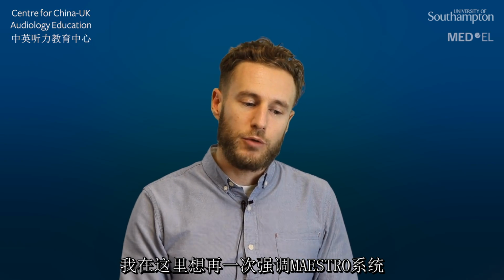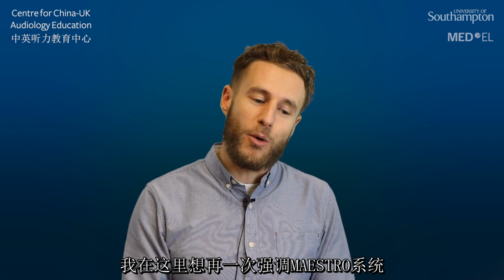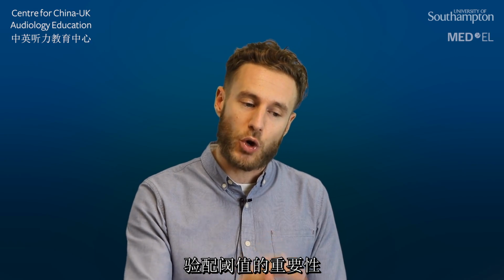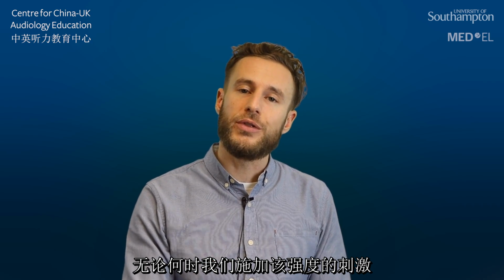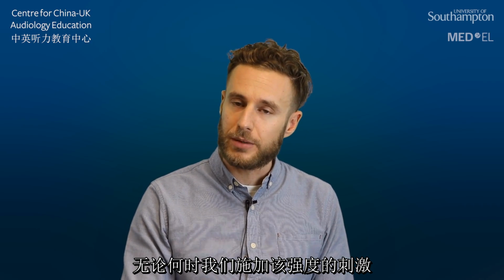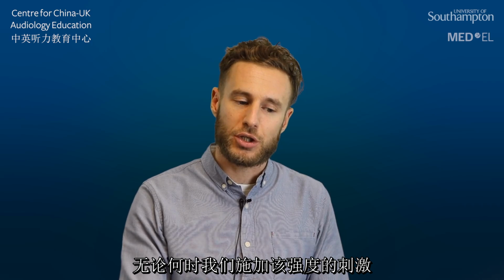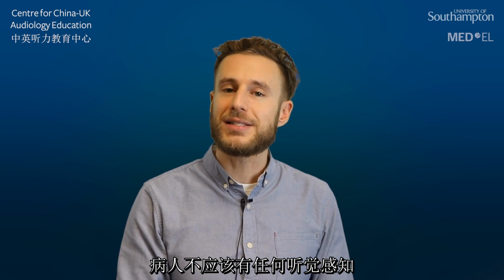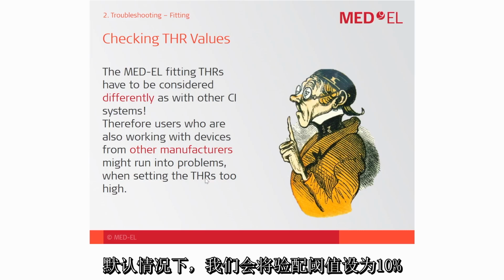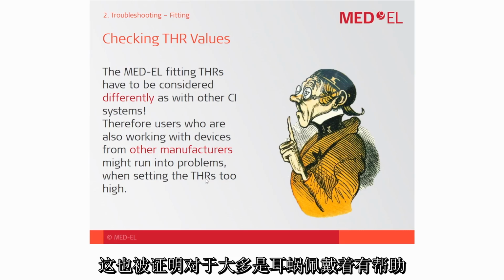So I would again like to highlight the importance of fitting thresholds in the Maestro system, as shown on the previous slide. It's important that the thresholds in the software are not audible. When we apply single channel stimulation at threshold level, the patient must not have any auditory sensation. By default, you can set the fitting thresholds to 10%, which is proven to be effective in the majority of all CI recipients.